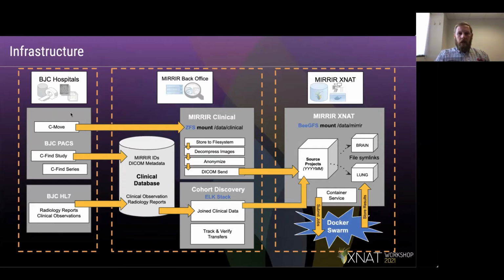As I mentioned, we're using the DIMSE services. We're excited, and hoping to get DICOMweb from the BJC IT team in order to start utilizing that. I think that'll be a game changer for us. Because we're currently, let me start here. Some of our automated processes, if you focus in here, we're doing loads and loads of C-FINDs basically to index this. And we can certainly keep up on a daily basis. It took months to do it retrospectively back to roughly the year 2000.